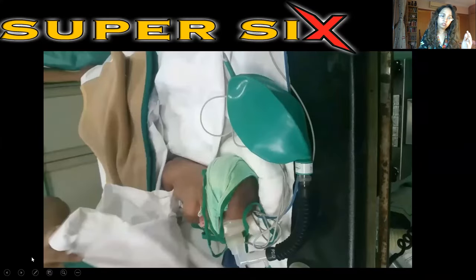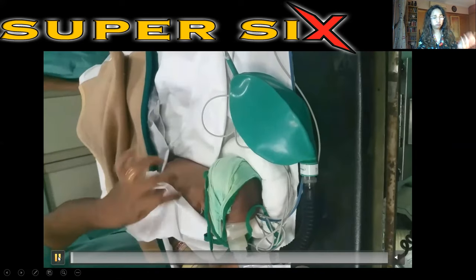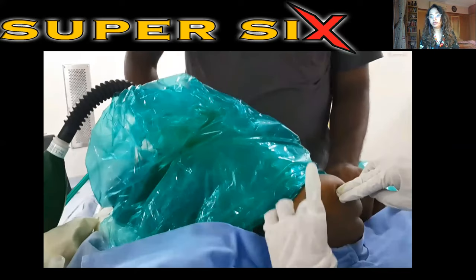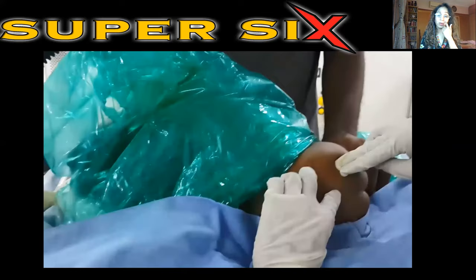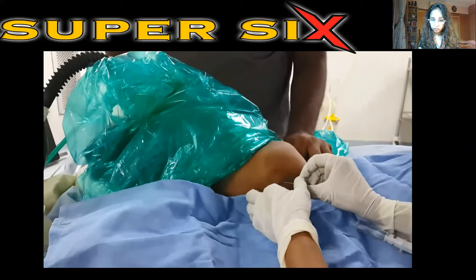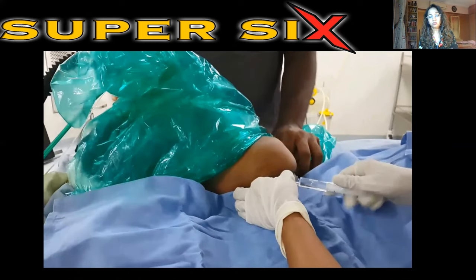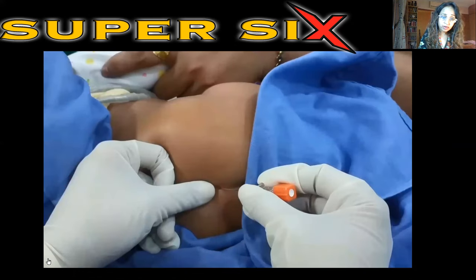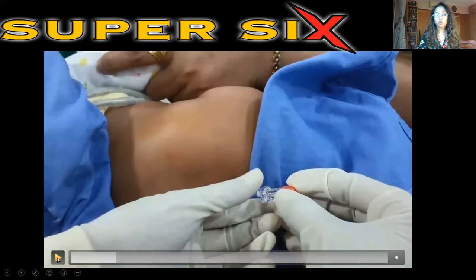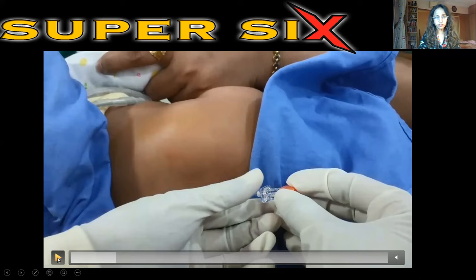To begin with, of course, is the good old caudal epidural block, where the baby is kept in lateral position. The posterior superior iliac spines are palpated, the sacral cornu is identified, the skin, subcutaneous tissue and the sacrococcygeal ligament are pierced, a give is experienced, and the calculated local anesthetic dose is injected. Here, there are certain special needles with stylets as well, so that we can prevent the skin tissue getting inside straight into the epidural space.